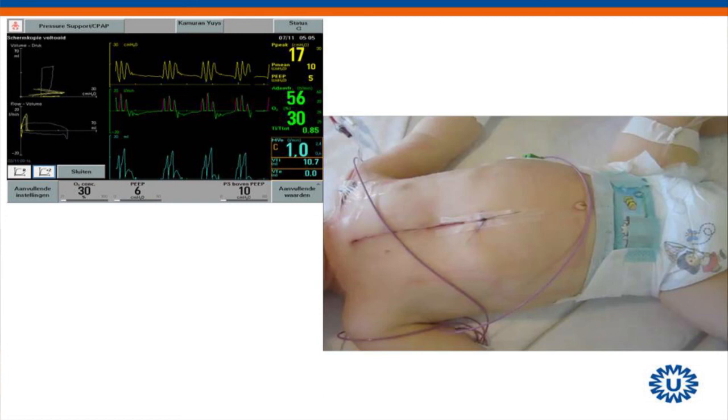Do you see auto-triggering a lot? Who does see auto-triggering? Not this. Not this, but the normal ones. Quite a lot, yes, unfortunately.